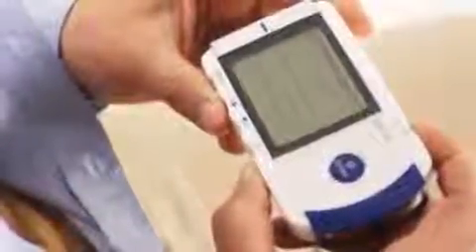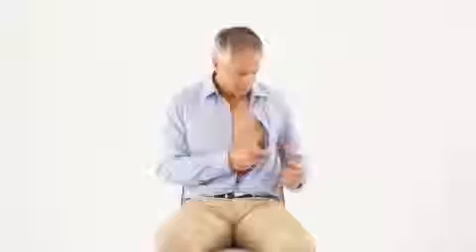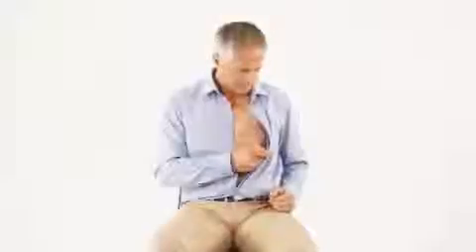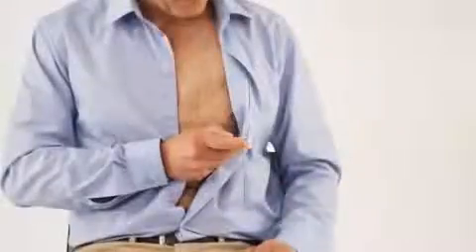Using the HeartScan is child's play and discreet as well. Ask your patient to sit down and bare the chest below the heart. Press the on-off button to turn the monitor on. Place a finger closely to the two-finger electrodes on the right side of the monitor. Place the chest electrode directly onto bare skin, approximately 5 cm below your left nipple. You don't need contact gel.